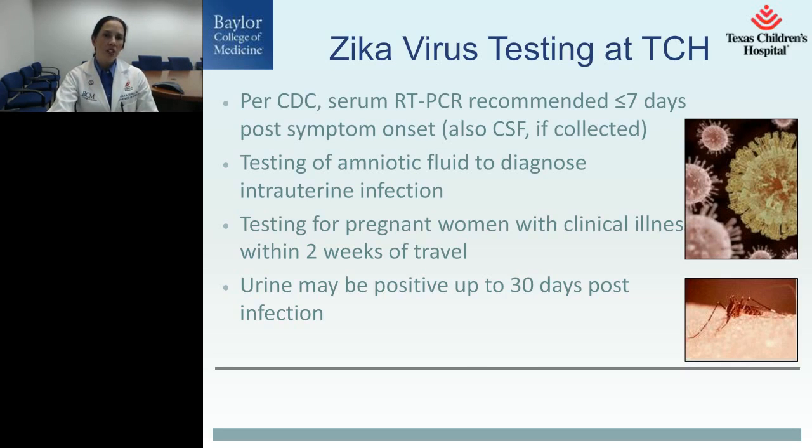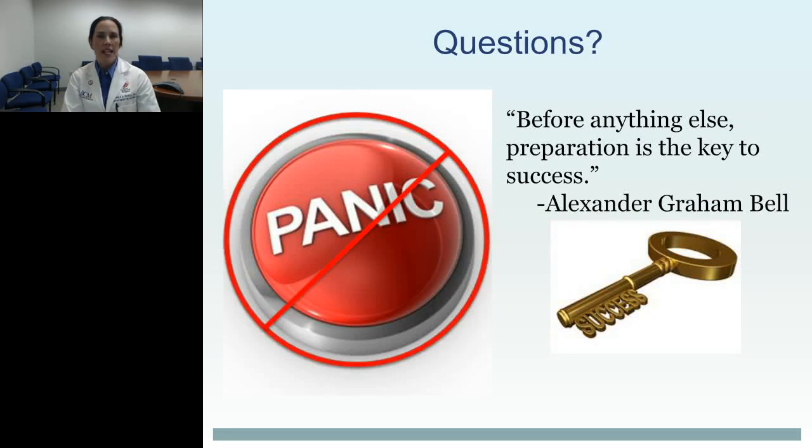So we actually went with an assay in that case that was commercially available in Europe, but there were no FDA-approved assays. And we did a similar type of validation that we saw with Ebola, where we use what we call contrived samples. So we spiked specimens with virus that we'd received from one of our colleagues who is a researcher in Colombia, and that allowed us to validate the assay and then go live.